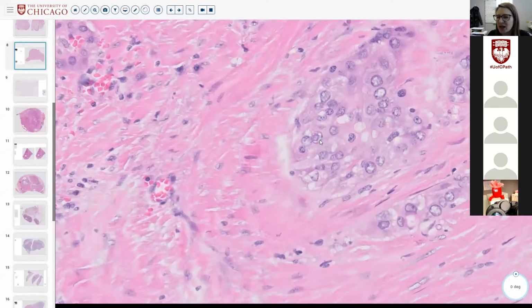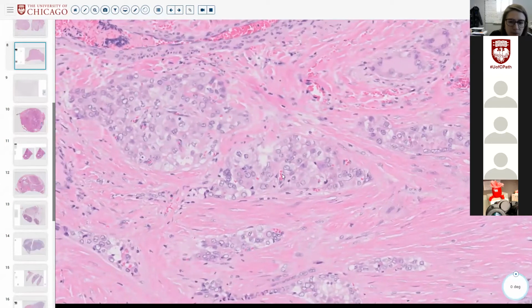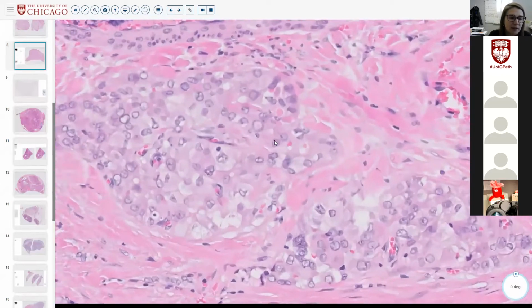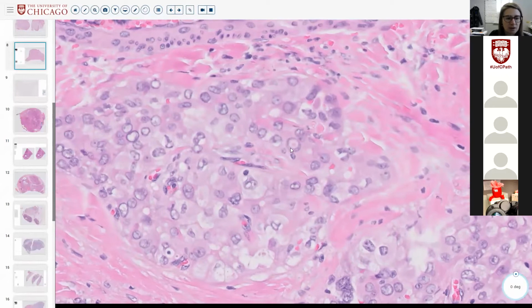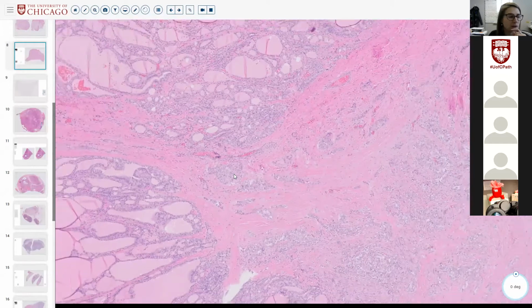They're a little bit not great on this slide. But yes, I would call this carcinoma regardless. So here's an inclusion. Pink cytoplasm, nuclear membrane, blue chromatin, nuclear membrane, pink cytoplasm. Look hard for those inclusions if you need to convince yourself.